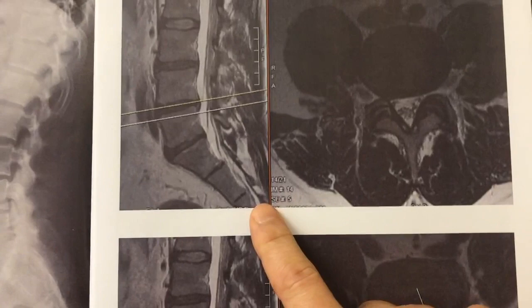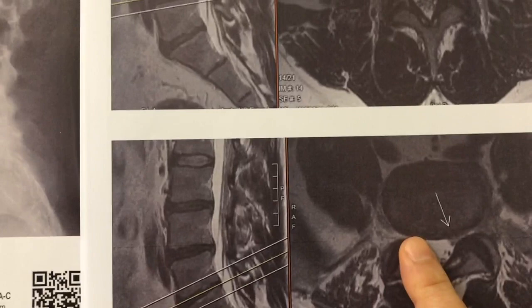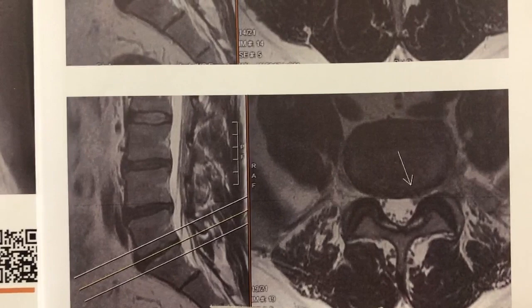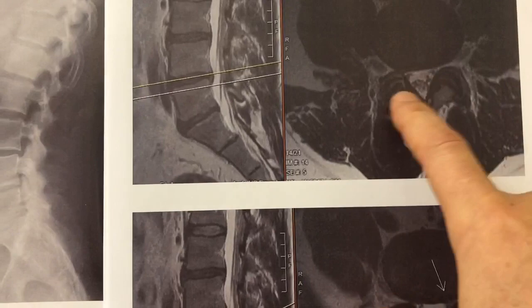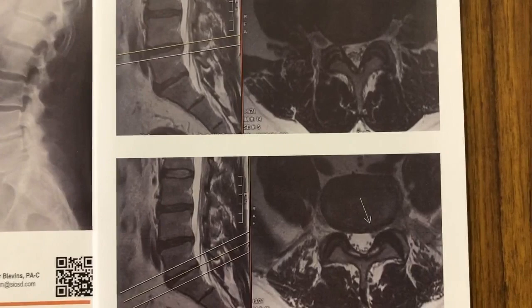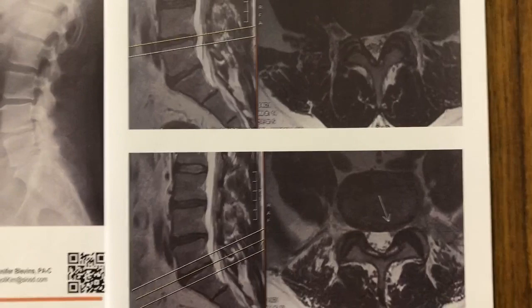Rather than doing a major surgery like a fusion, we've decided to go in and do a transforaminal endoscopic annuloplasty — releasing the nerve and removing entrapped disc fragments at L4-5, and same thing at L5-S1. The nerve is usually tethered down as part of the healing process due to the inflammatory response. Our goal is to release the nerve and initiate a more normal healing response by removing these annular tears that perpetuate this chronic inflammatory process and cause chronic pain and disability. We'll be able to do this through one poke hole even though it's two separate trajectories — just a band-aid and a rapid recovery.